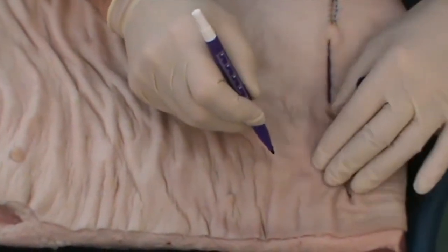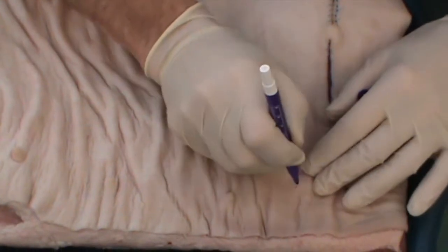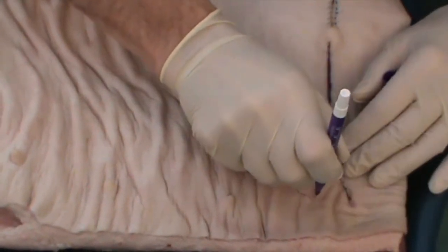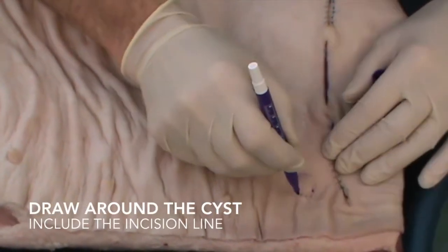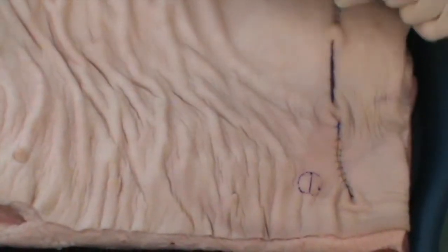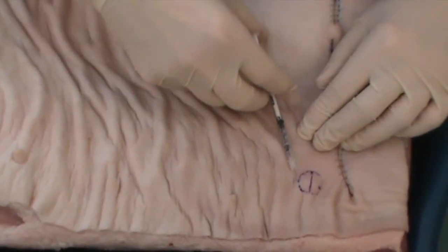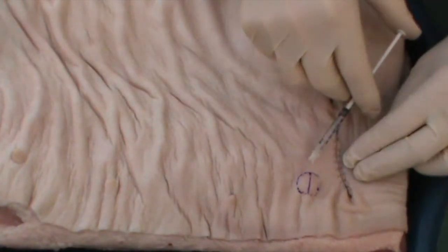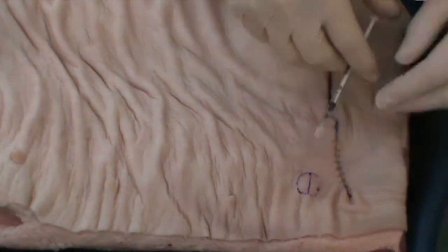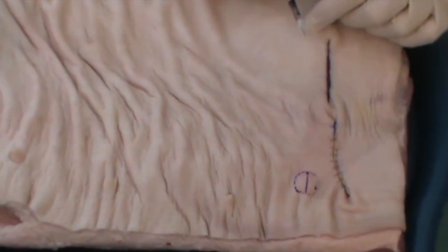Here we have the equivalent of an epidermal cyst, albeit an artificial one. For these, I find that working out the approximate size of the cyst, followed by the intended incision, is key. When anaesthetising these, I tend with a diabetic needle and syringe to work my way around like this with the anaesthetic, and then from the anaesthetised side, work all the way round so that the whole area is anaesthetised.